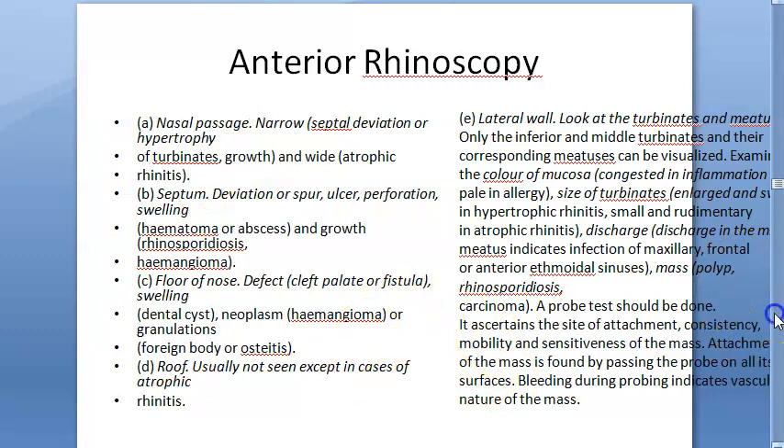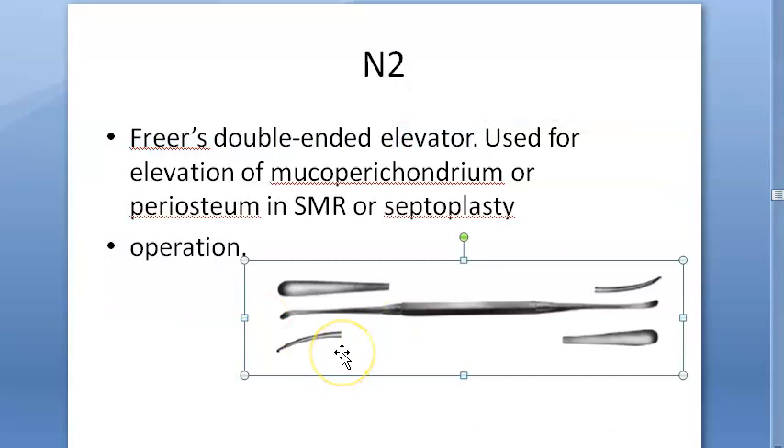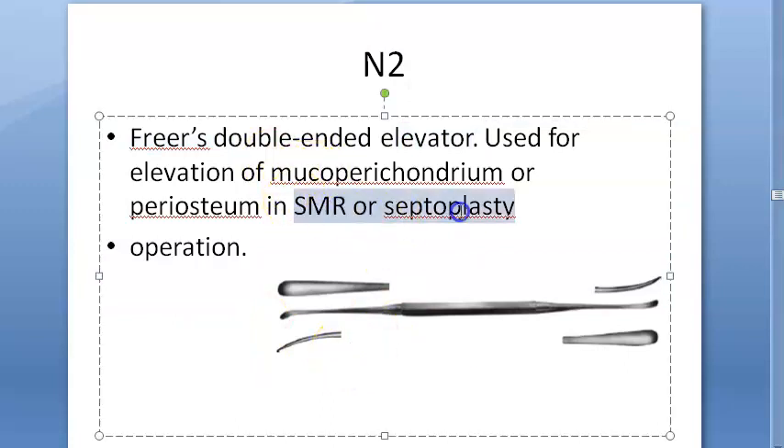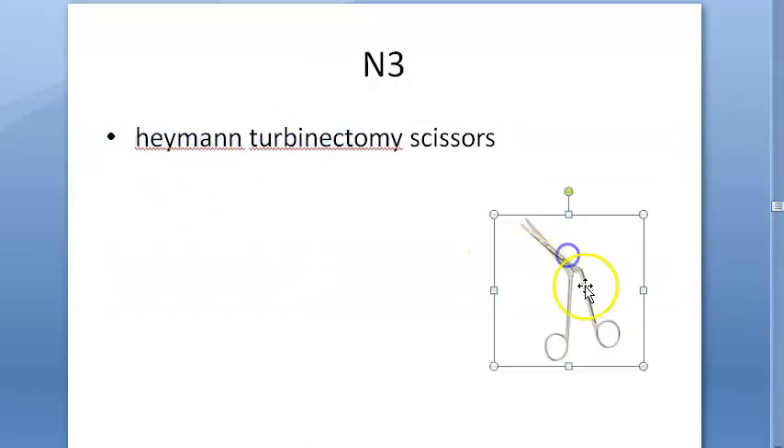Next is the Freer double-end elevator. It is double-ended, and you use it to elevate the mucoperichondrium and periosteum in any septal surgery. You can elevate with either end.